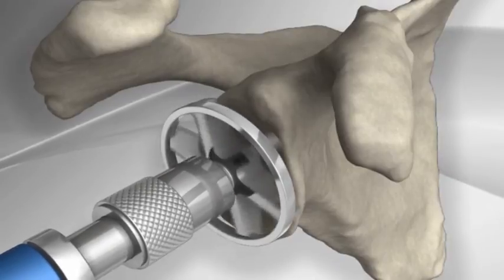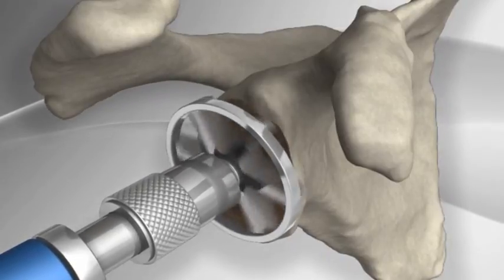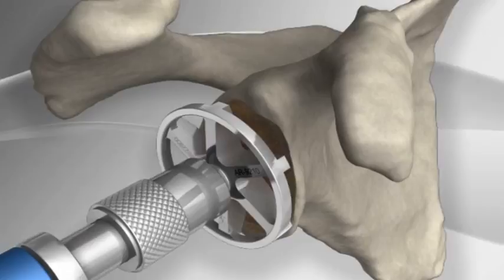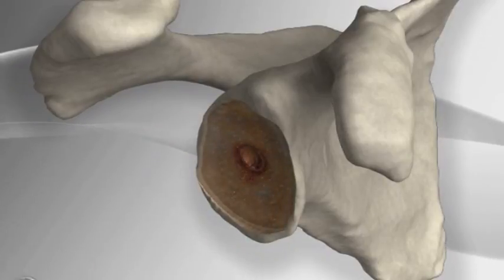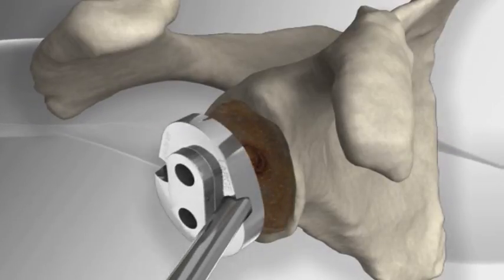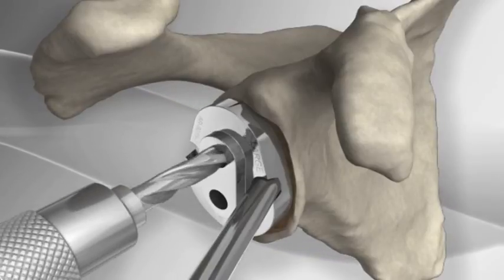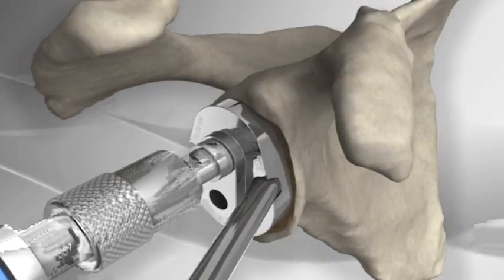A bone cutter is used to smooth the glenoid to fresh bleeding bone. This allows the prosthesis to heal attached to the bone. A second guide is inserted and a hole is drilled above and below the center hole.